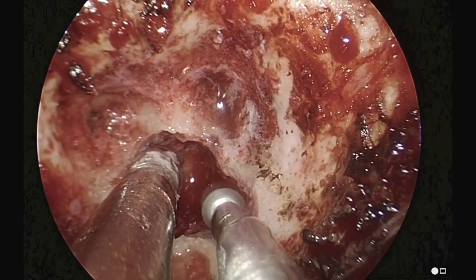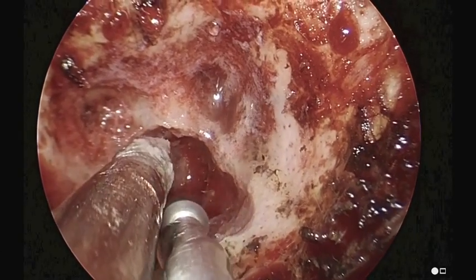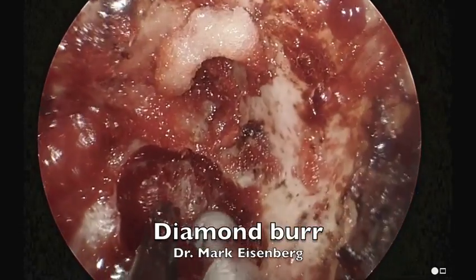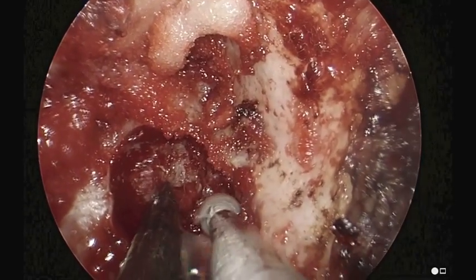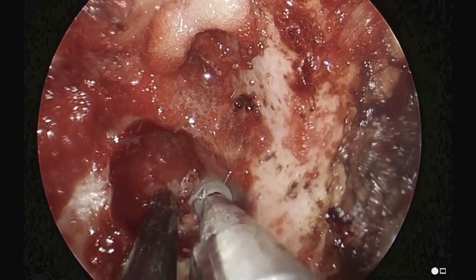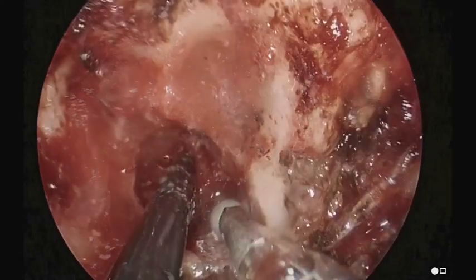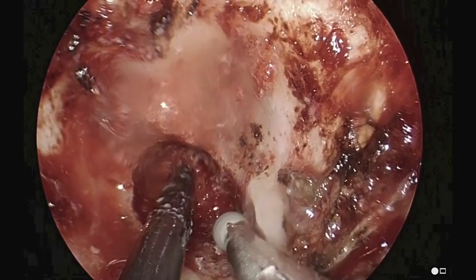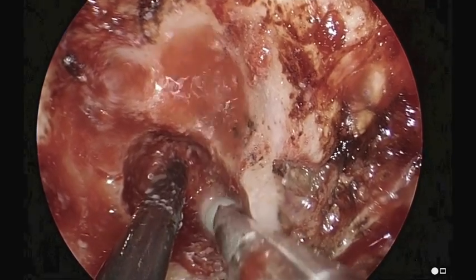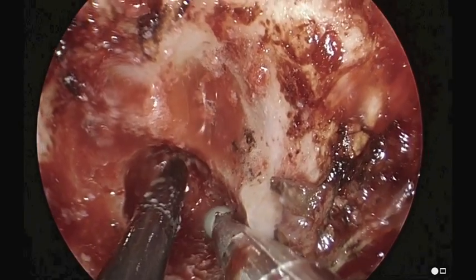As we move more lateral, we continue the drilling. We're getting closer to the carotid artery. We've changed over to a diamond burr, which is a less aggressive burr, and slowly undercutting the bone here to gain access to the petrous apex granuloma cystic wall cavity.